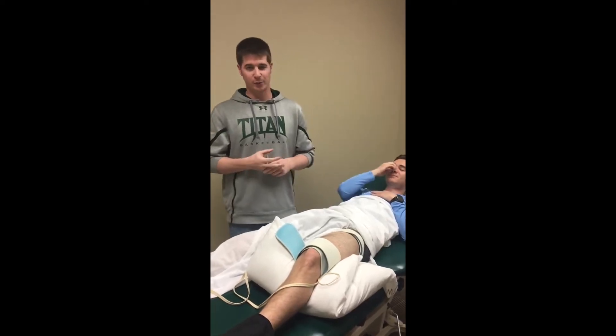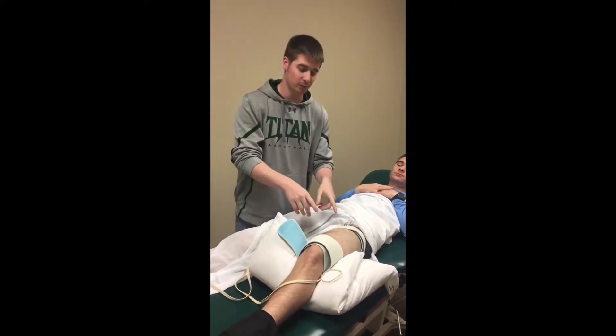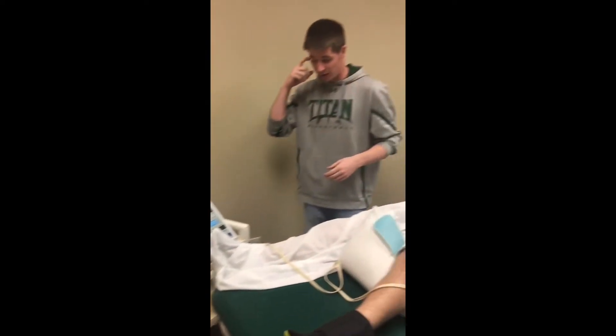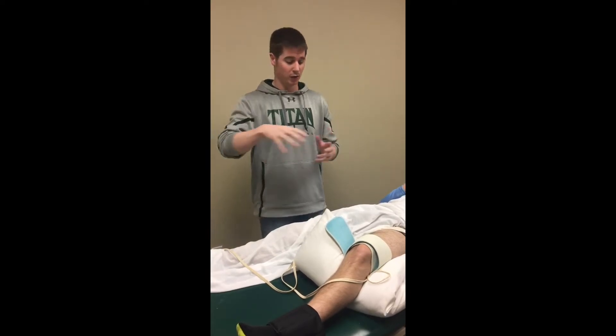We are going to be doing neuromuscular electrical stimulation for strengthening of the quadriceps muscle using pulsed current with the Isotron 3 machine. We set it up for biphasic current.